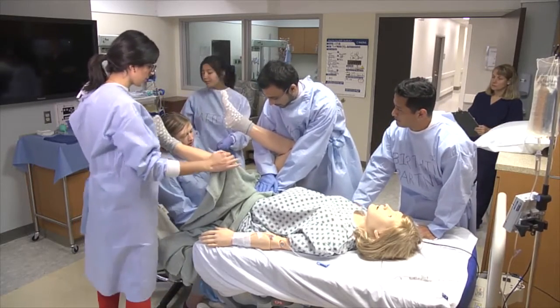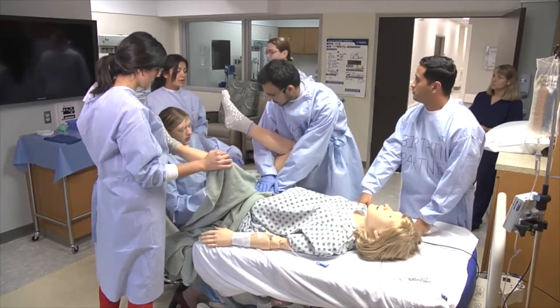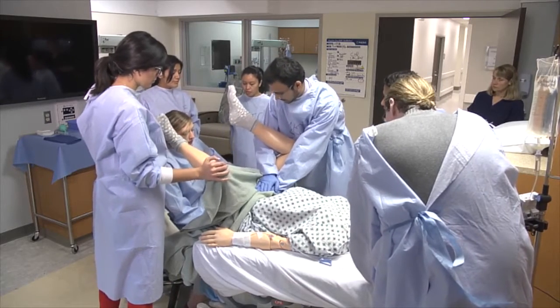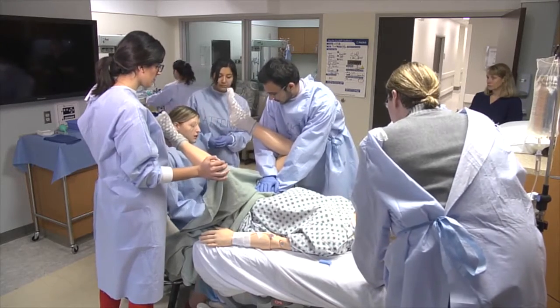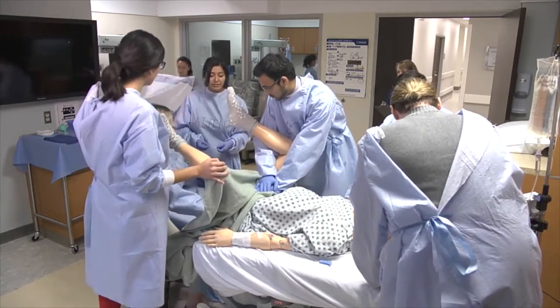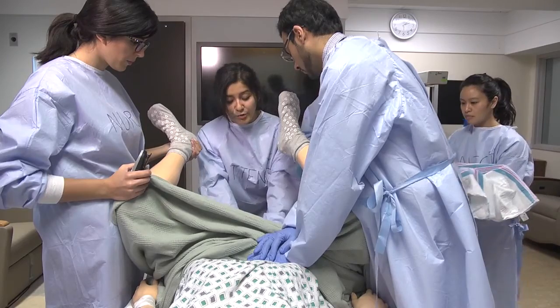Okay, you're going to make a left medial lateral episiotomy. Scissors. Anesthesia here — what's going on? We have a shoulder dystocia, we might need to go back to the OR. You can hear what's happening — we have a shoulder dystocia, she's 39 weeks, it's her second pregnancy and she had gestational diabetes. What time is it? One minute 30 seconds. Okay, let me try and deliver the posterior arm. It's not budging. I'm going to try a Woods corkscrew maneuver.